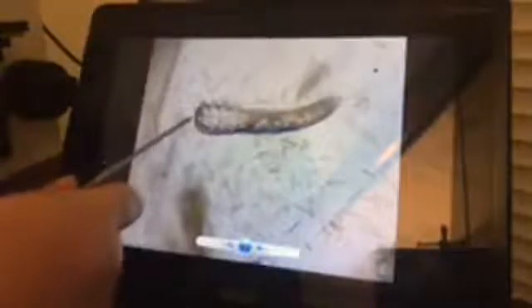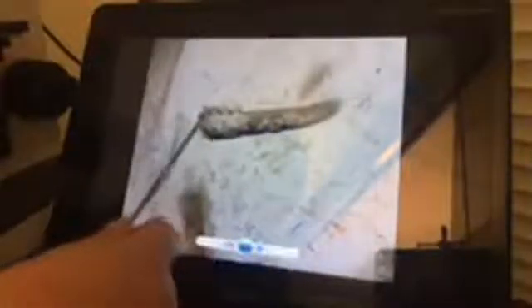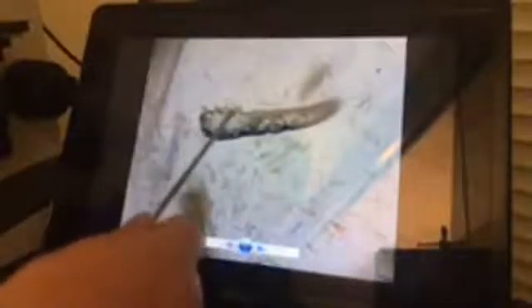So you can see there's two mouth parts here. This is how they actually consume the oils from your skin. They're so tiny, so it's quite hard to focus on all of them at once. And you can see it's an adult because it has 8 legs, so 4 on each side. And I hope you can see it on the camera, but the legs are actually moving around.